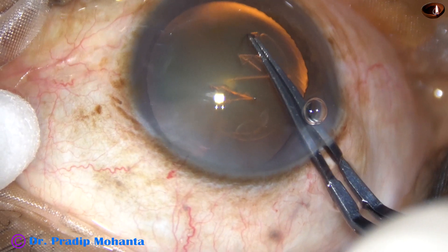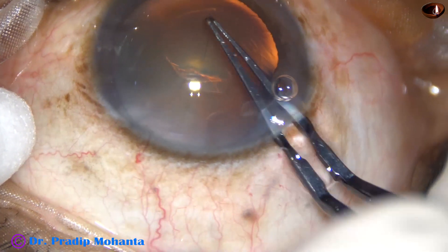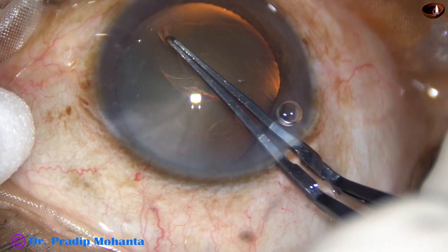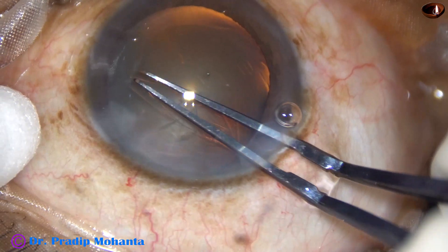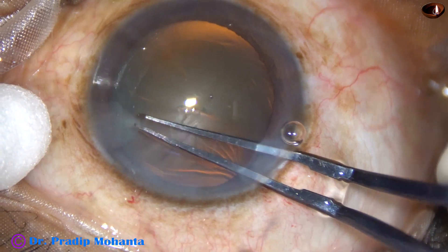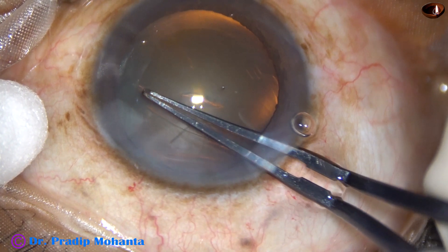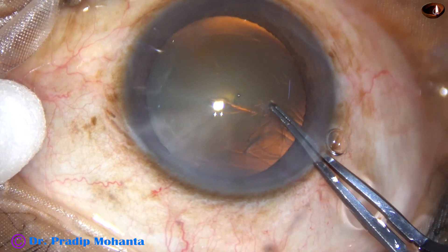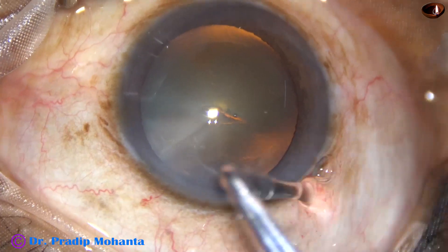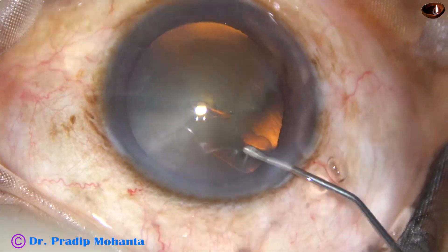Remain at a certain distance away from the margin of the dilated pupil, and always keep the anterior lip of the main wound lifted up. So two things to take care of: keeping the anterior lip lifted, we move the rhexis forceps all around and complete the capsulorhexis.